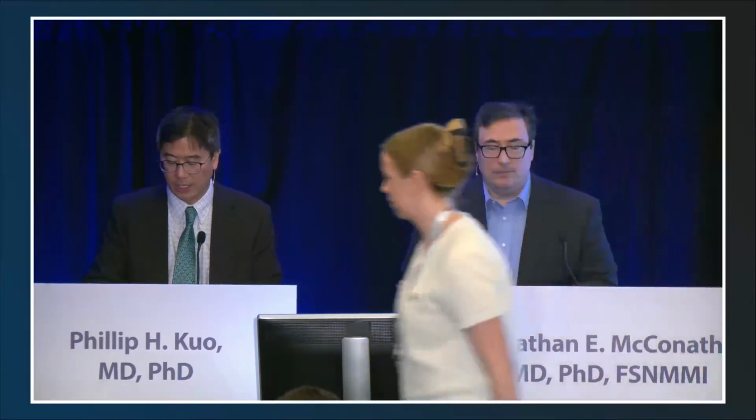That sounds good. So one of the first questions was, what is the correct way to window the Vizamyl images to avoid inter-observer error, since wrong windowing can make a study false positive or negative? The correct way to window Vizamyl images is to use the pons as your big band of white matter, basically. And it's supposed to be windowed at 90% of maximal intensity using a linear color scale, such as the Rainbow or Sokolov, which is common on a lot of the software.